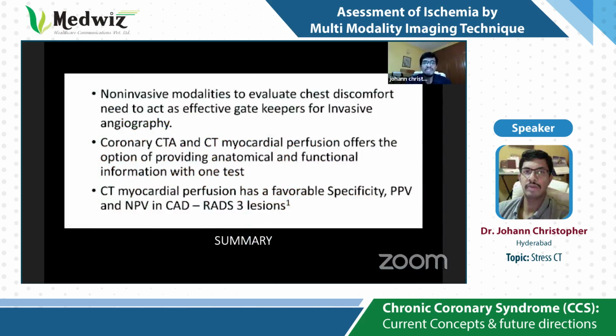So ladies and gentlemen, in summary, non-invasive modalities to evaluate chest discomfort need to act as effective gatekeepers for invasive angiography. Otherwise, we'll be left with that 37% of PCIs only. Coronary CTA and CT myocardial perfusion is a new kid on the block, but it does offer the option of providing anatomical and functional information in one test.